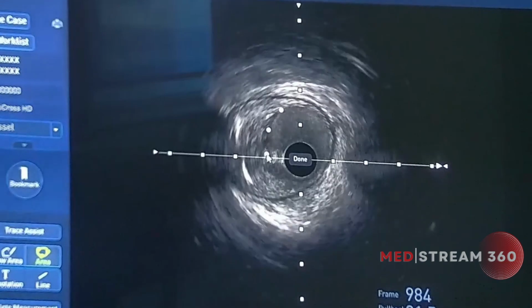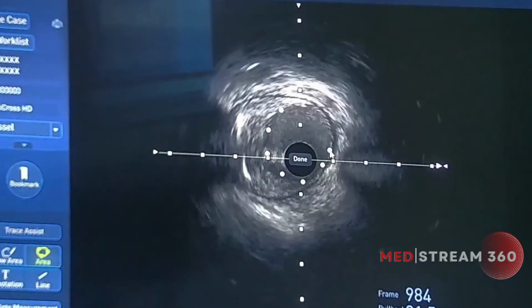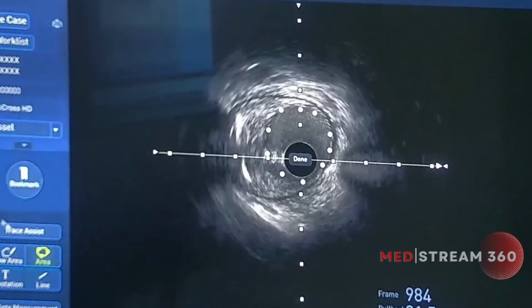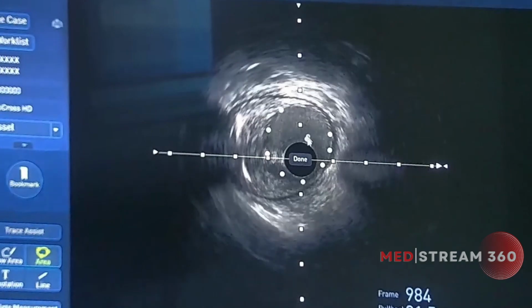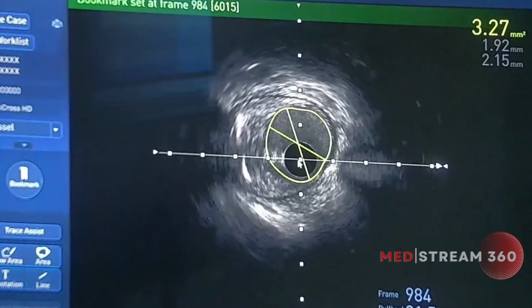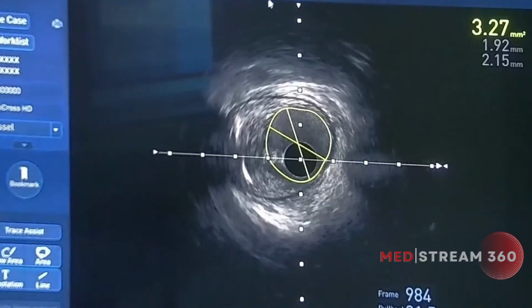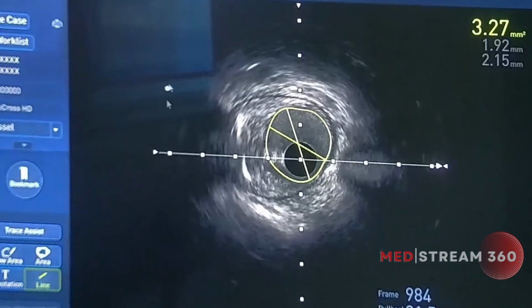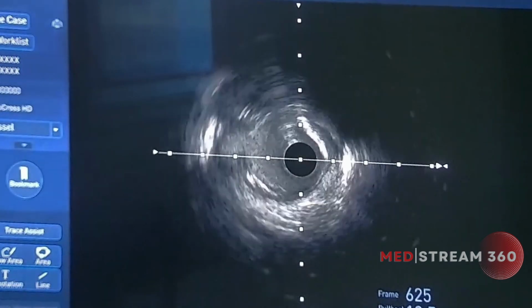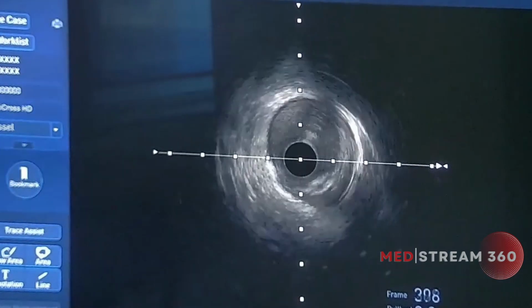Yeah, and implant a stent. And can you measure a healthy landing zone distal to this part? Probably between. That's the problem. Which is the best part? 2.5 probably. Probably more or less here. Yeah. I think 2.75. 2.75 could work well. Okay.